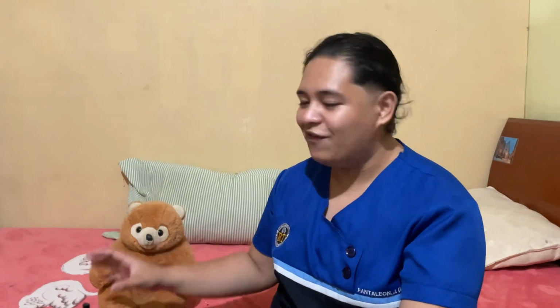Next is to place the patient into a comfortable sitting position or the semi-Fowler's position. Diaphragmatic expansion and lung compliance are greater in this position. This promotes the maximal effectiveness of medication in the basilar areas of the lungs.